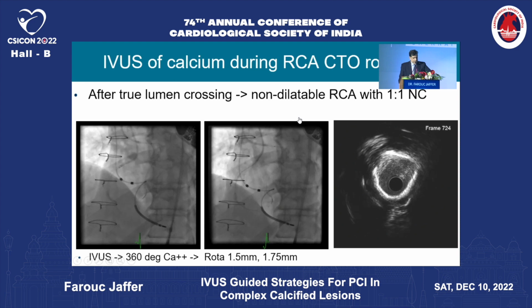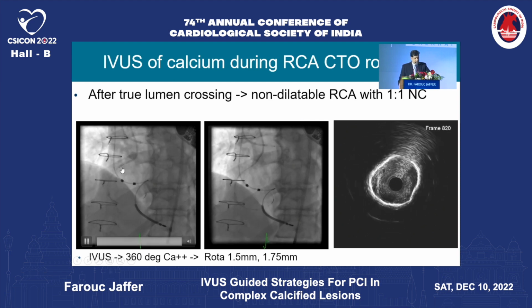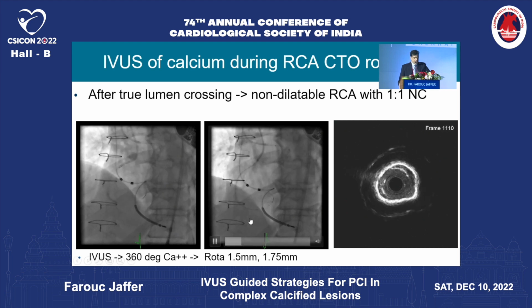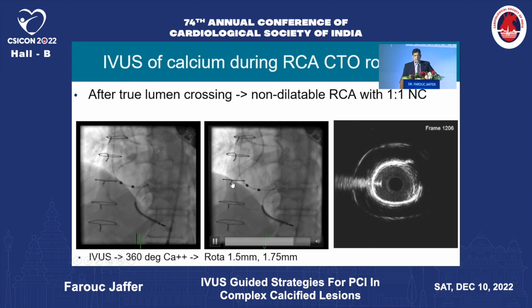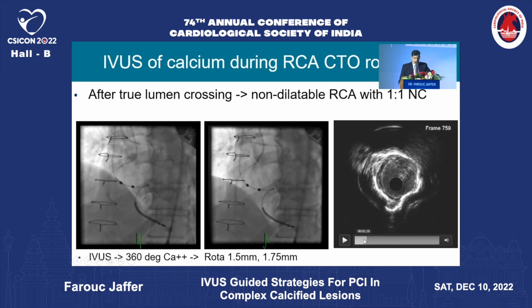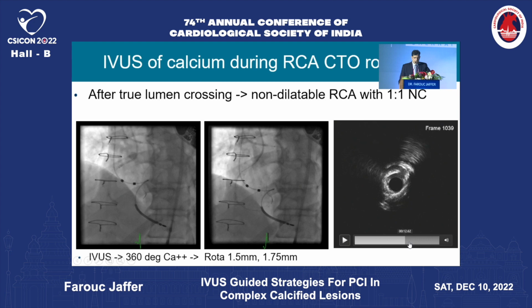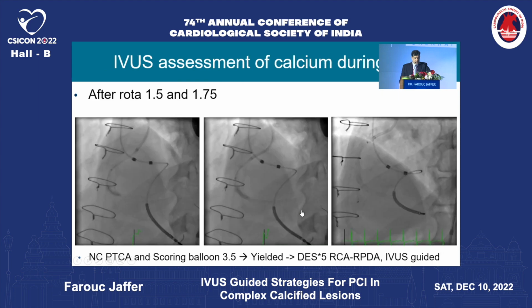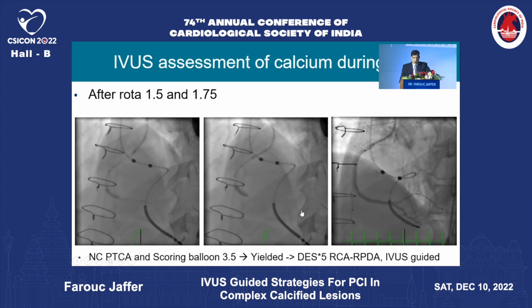Here is just a brief example of the importance of understanding calcium, even in total occlusions, where sometimes we're thrilled to have crossed with antegrade true lumen. We can often be faced with non-dilatable lesions that are severely calcified. And sometimes, especially if it's taken a long time to cross, it may take a moment to pause and really take that IVUS out. But in this case, when it's non-dilatable, here you can see the entire vessel has 360 degrees of calcium. It's over more than 5 millimeters. This is definitely asking for rotational atherectomy as the next maneuver. And I should mention this was a retrograde wire true lumen crossing, and we swapped out. And this ultimately led to dilatation and stent deployment.